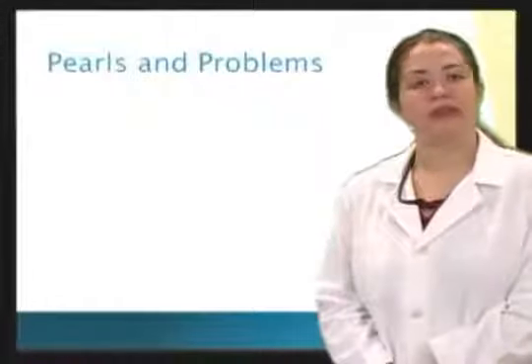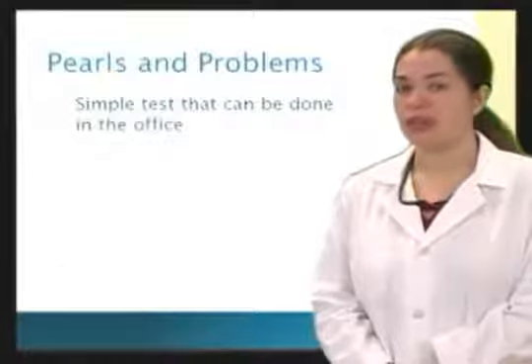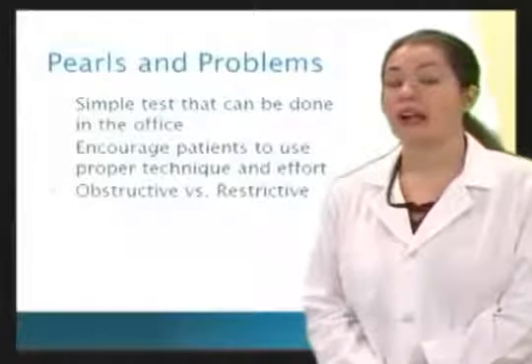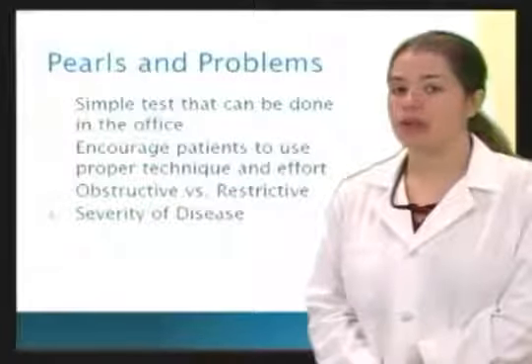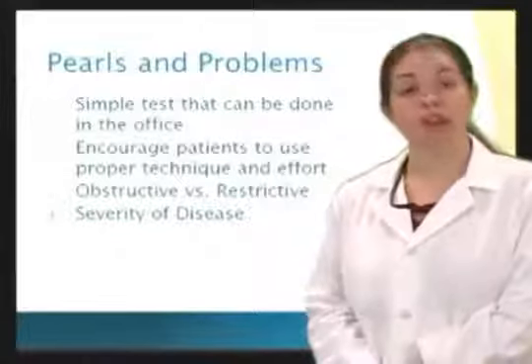Here are some pearls and problems about spirometry. It's a simple test that can be done right in your office. You need to encourage patients to use proper technique and effort to get accurate readings. It can help us classify obstructive versus restrictive versus mixed disease, and it can also help us determine the severity of their COPD. That's all for us on spirometry.